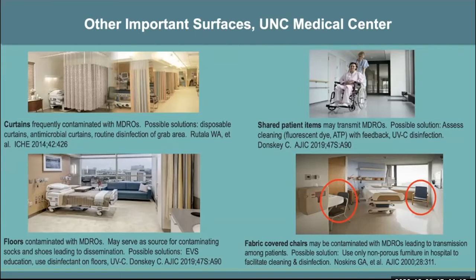Shared patient items, again, another study by Dr. Donsky, if not properly cleaned, can transmit multi-drug resistant organisms. Again, you can use a standard disinfectant, use fluorescent dots to prove they're cleaned, or you can use something like UV disinfection. Dr. Donsky has studied floors and shown they can be contaminated.